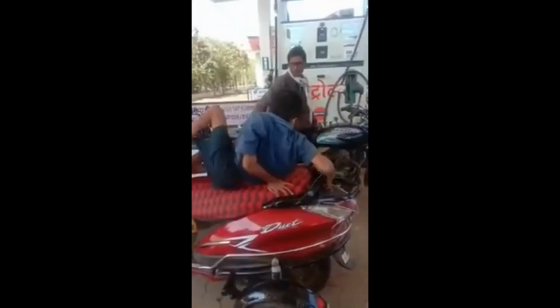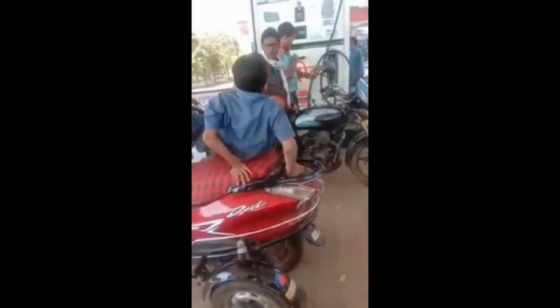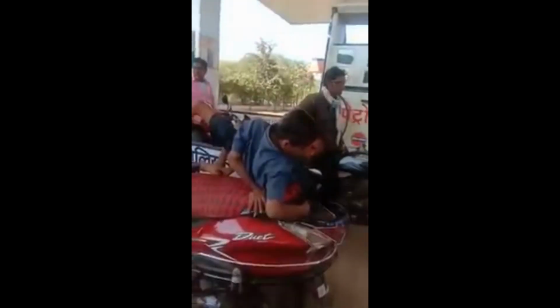Lastly, now I am attaching a video. I was stunned while seeing this video in the YouTube few years back. You can see the entire video again and again. I am giving a question. Now tell me, what is the type of this conjoined twins? Please give your answer in the comment section without fail.